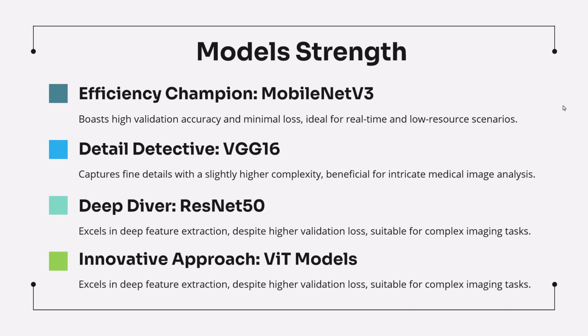The final thing is the innovative approach of the vision transformer models. They excelled in deep feature extraction despite higher validation loss. They're suitable for complex imaging tasks. Each model presented us with a different strength, highlighting the importance of application environment and application size.